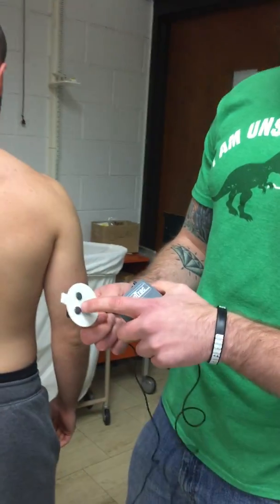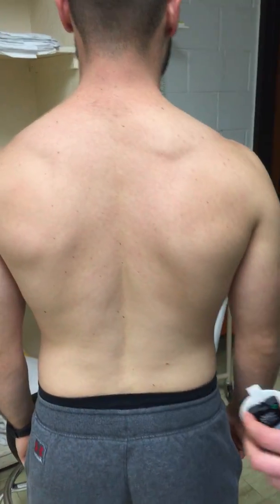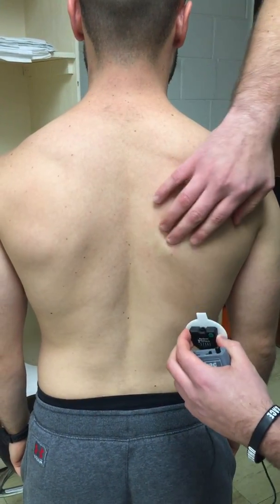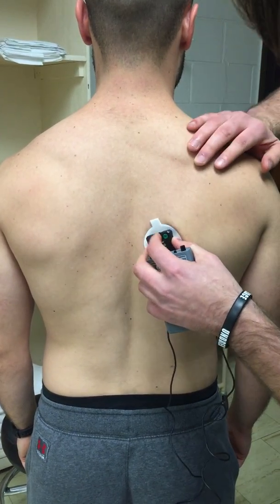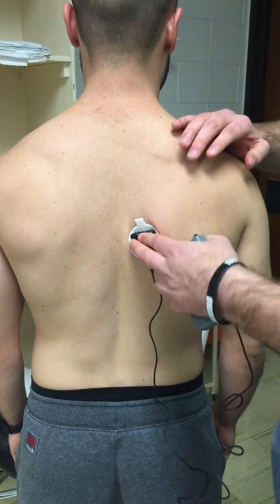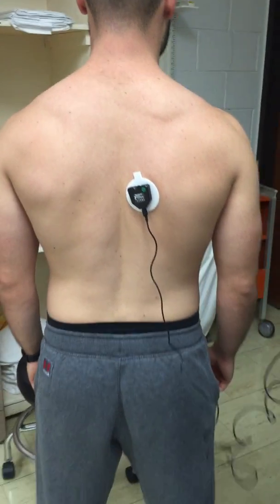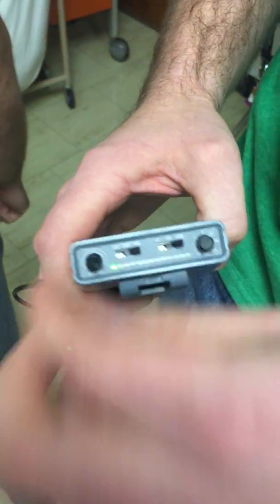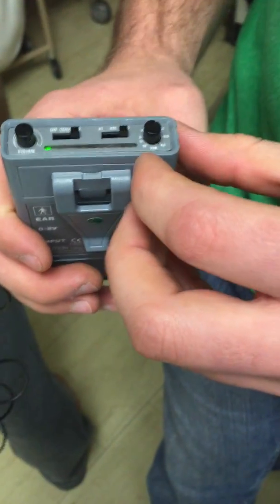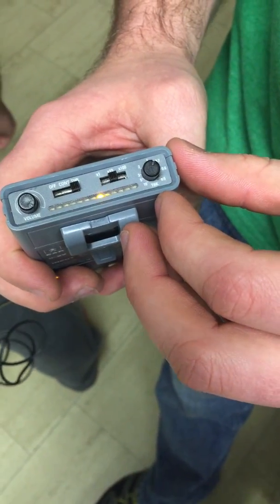Taking the MioTrac device, lining these top two leads on the pad with the middle trap — going on the middle trap here, up there are the muscle fibers. We will turn on the MioTrac device to threshold, volume is all the way up, and we're going to have him perform a muscle contraction. We'll turn it down to see what he can actually achieve.